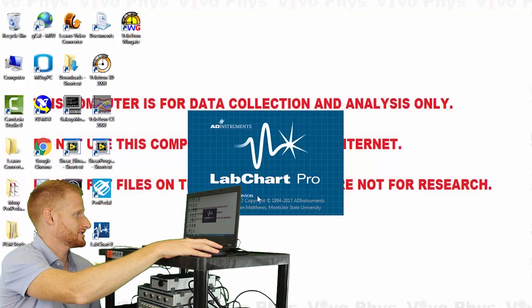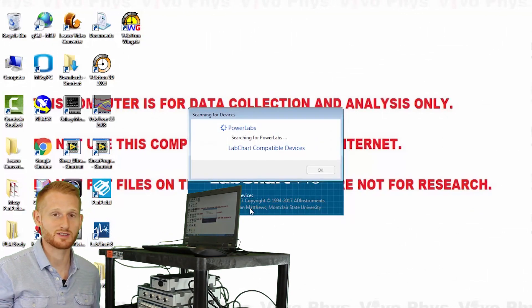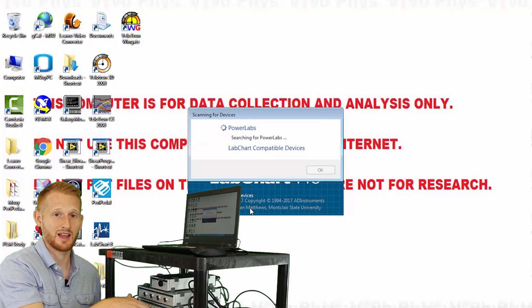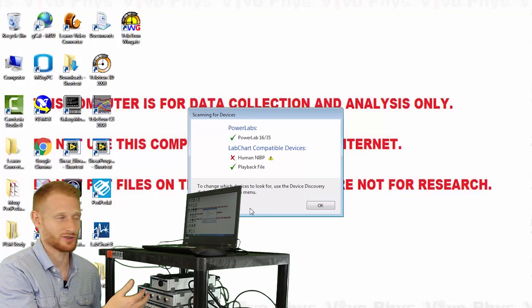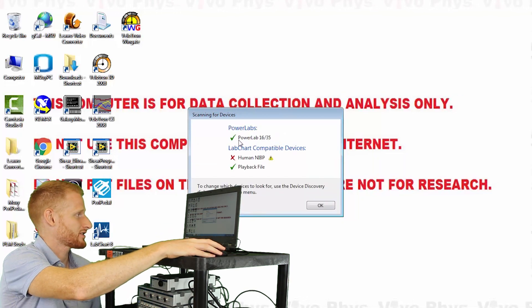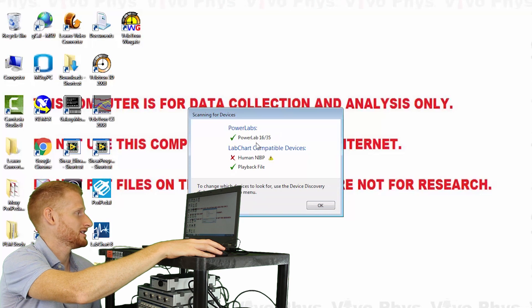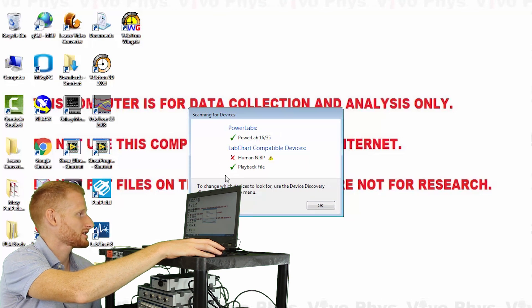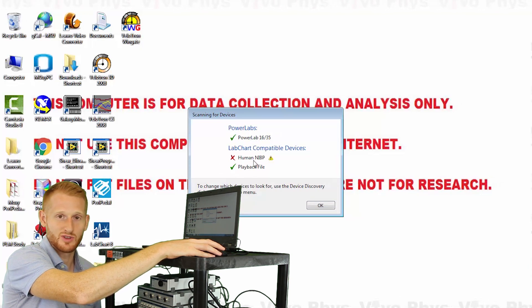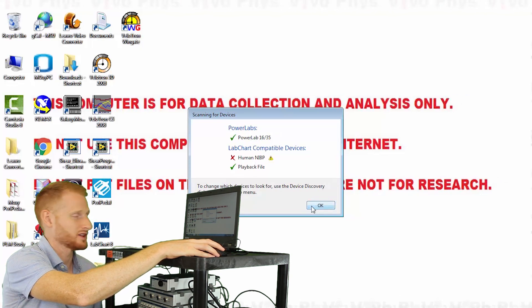Now it's scanning, looking for the devices. It's specifically looking to make sure the PowerLab is connected and turned on, and you can see here it's got the green check, so it is turned on and connected properly. These are the ones we're not going to be using, so let's just ignore that for now and click OK.